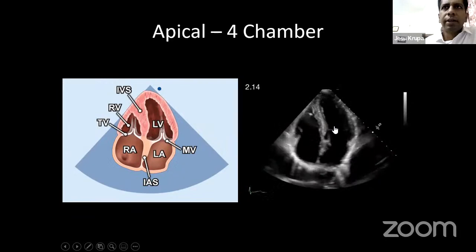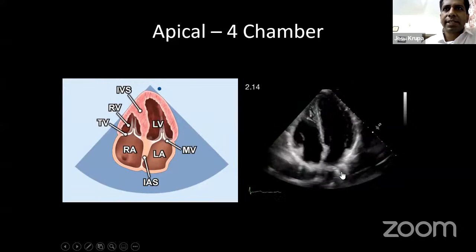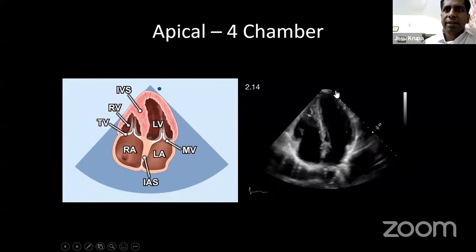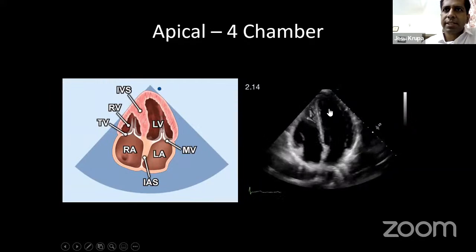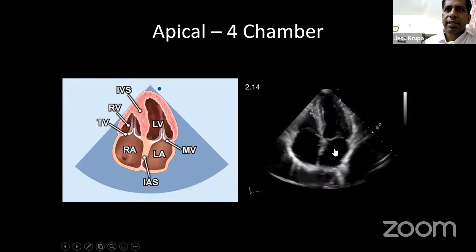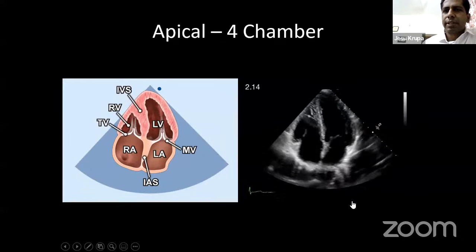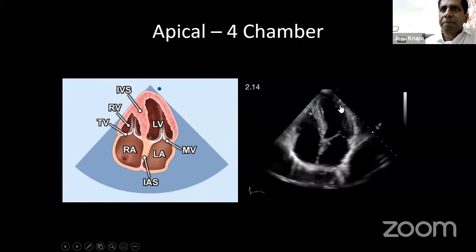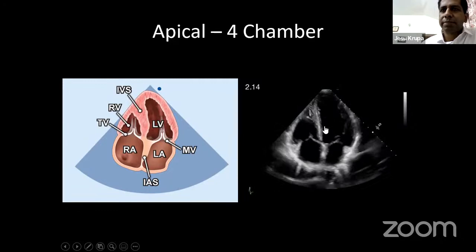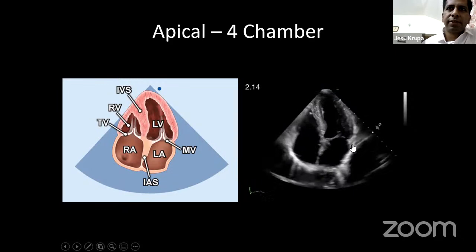The four-chamber view is intuitively the simplest to understand — you see the heart's four chambers, though it is upside down since the probe is at the LV apex. You see the left ventricle, mitral valve, left atrium emptying into the left ventricle, the interventricular septum partitioning the left and right ventricles, the interatrial septum partitioning the left and right atria, and the right atrium emptying into the right ventricle through the tricuspid valve. From this view you can identify LV dilatation, ventricular or atrial septal defects, and mitral stenosis.